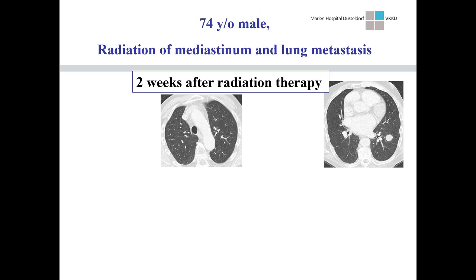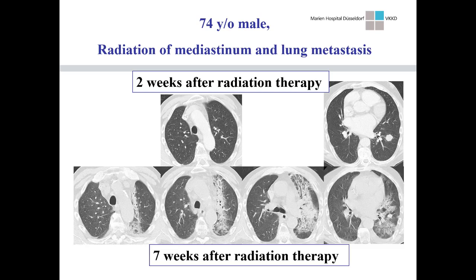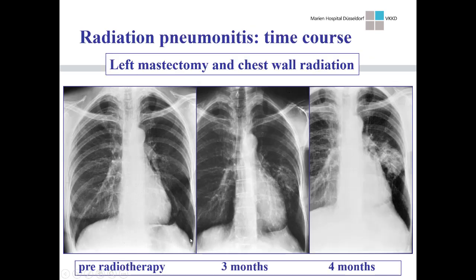Usually, immediately after therapy we don't see anything. This patient underwent complex radiation for the mediastinum and a single lung metastasis — two weeks after radiation there is no abnormality, which is normal; it's too early. Seven weeks after radiation therapy the image has completely changed: we see a consolidation with a sharp border crossing the anatomical border of the lobar fissure, and around the metastasis some more diffuse consolidation. So: no findings early on, then consolidation after two to three months of reaching the threshold dose.